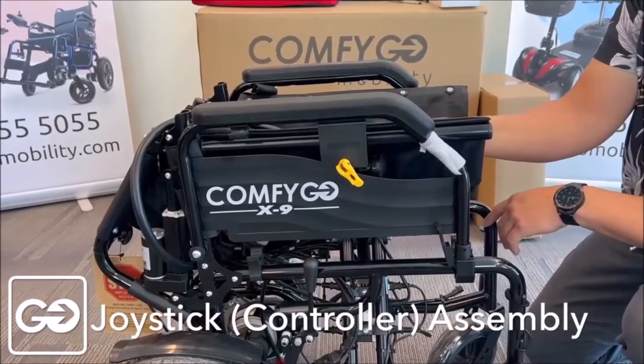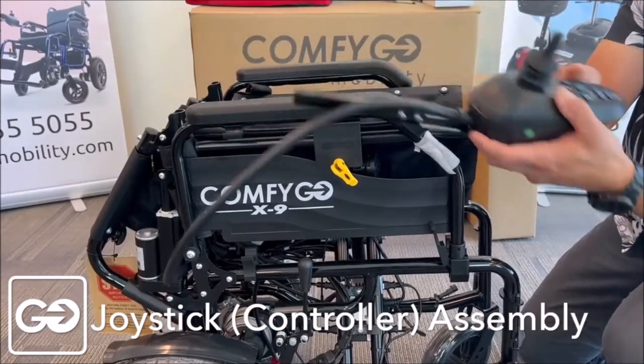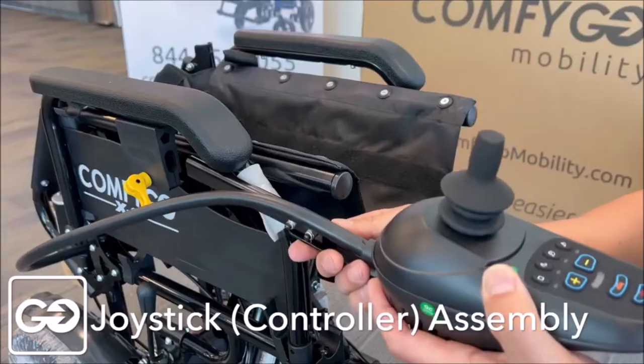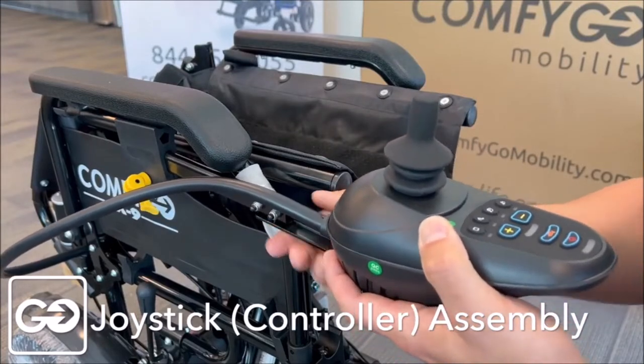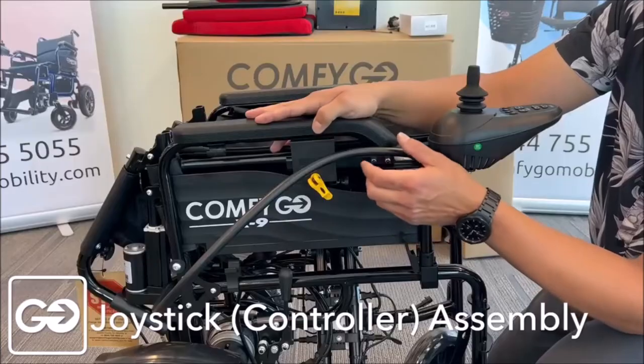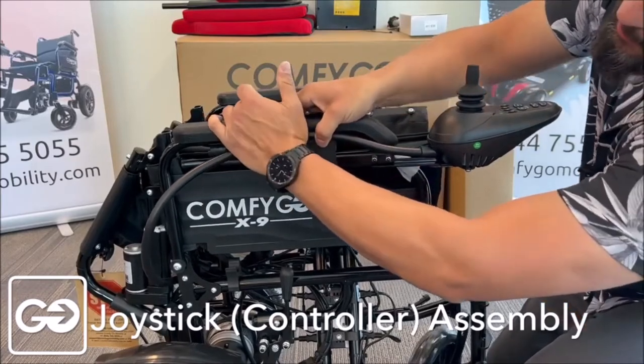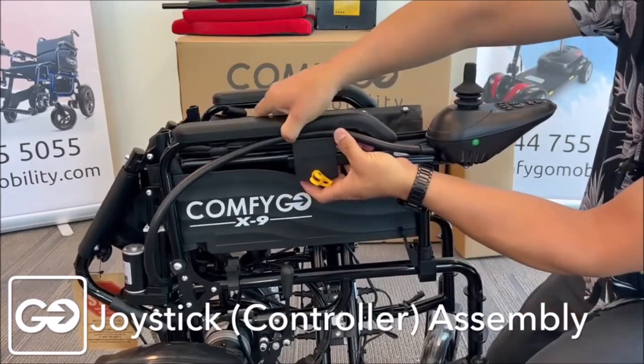One of the first things you want to do as part of the assembly is go ahead and install our joystick. You'll notice there is a slot here — we're going to push the joystick bar in. When your joystick is in, take this wire and just push it snugly up inside right underneath that hand bar.